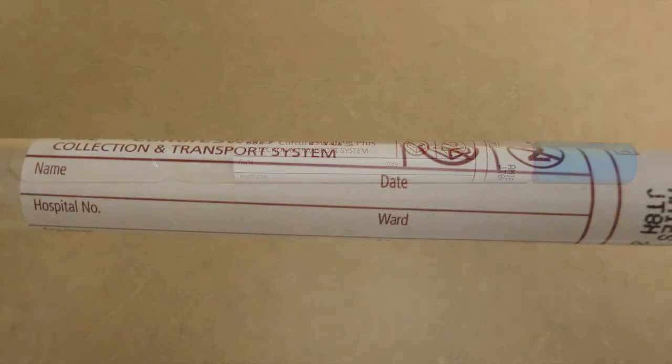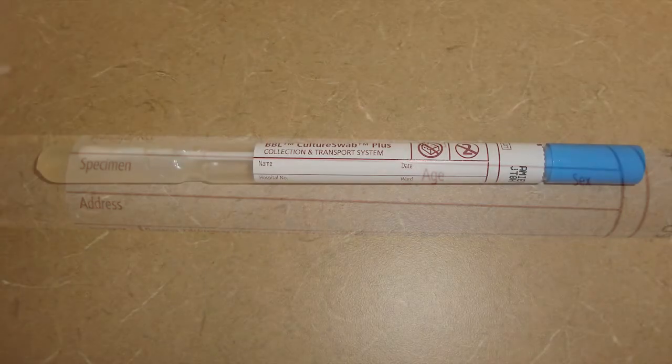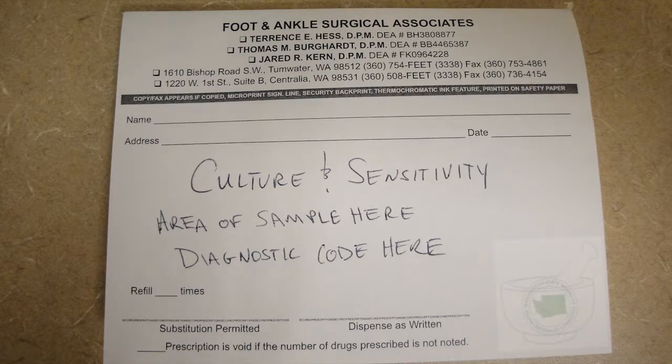You'll need to write the name of the patient, date, culture taken, and doctor name on the swab. This information is very important, and it's crucial that it's placed on the side of the swab, or the lab will throw it away. In Tumwater, you'll need to print out a demographic sheet and have the scribe write a prescription for culture and sensitivity for the specimen.